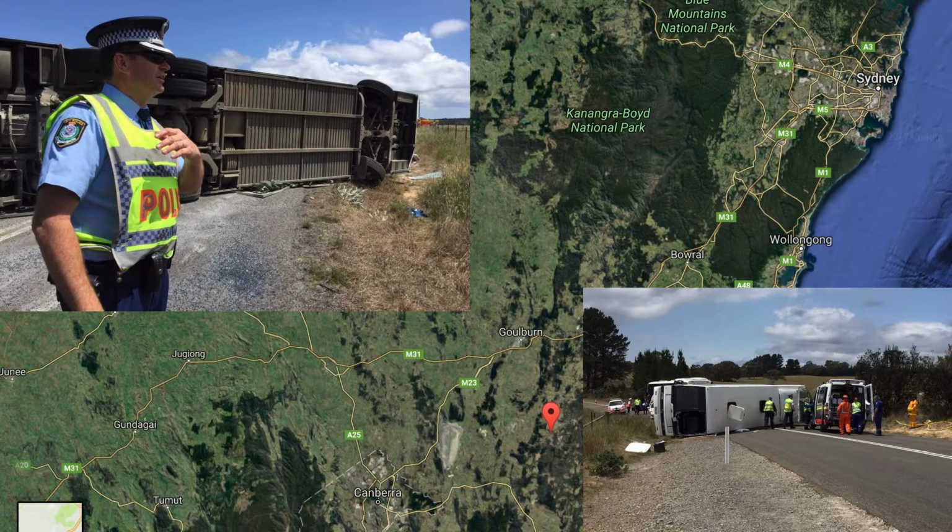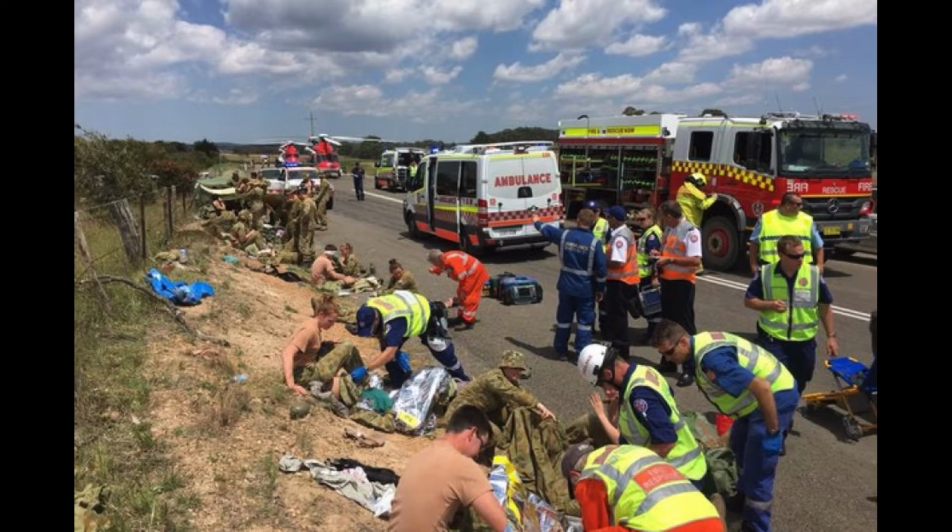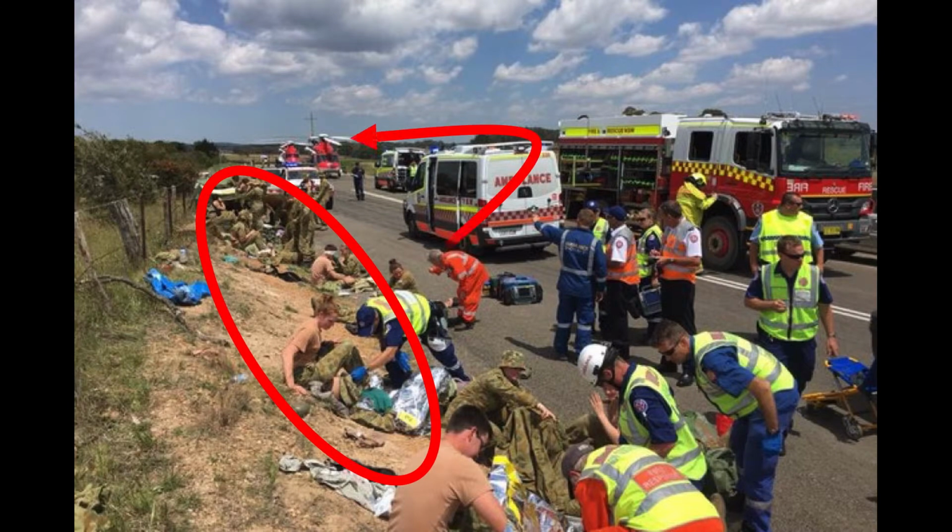Coming across a scene like this with a few dozen young patients, all with stable vital signs but some pattern bruising and some abrasions, the use of ultrasound at a scene like this would help us to determine which of these guys gets priority for aeromedical retrieval to the major trauma center, ideally before they deteriorate.